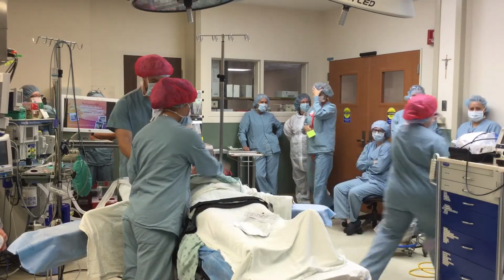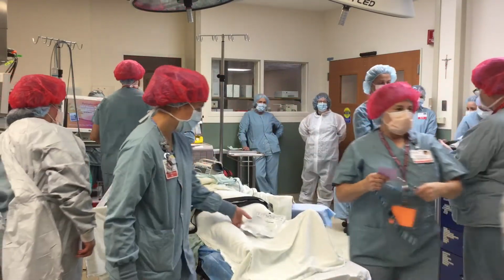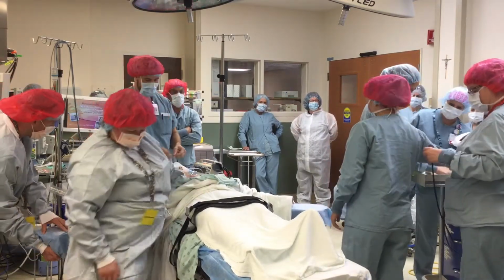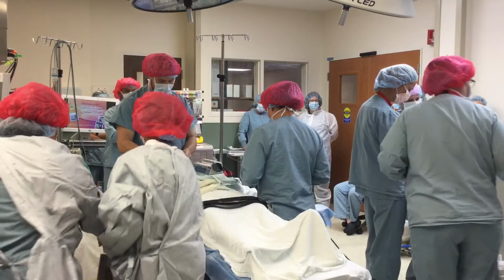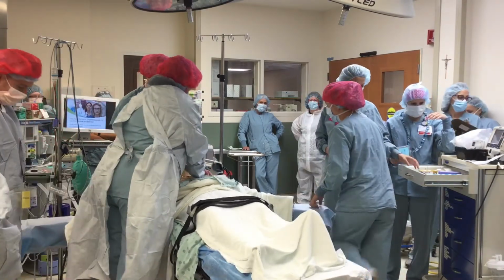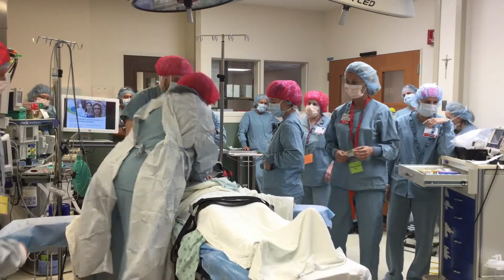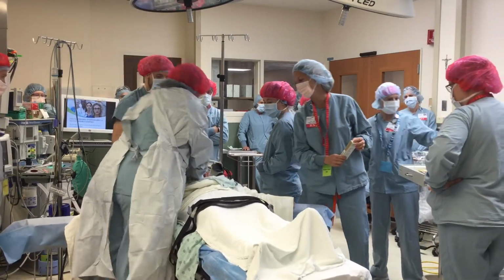Somebody needs to start CPR. We need a compressor to start CPR. I need a documenter. We have a secured airway. Okay, so I'm gonna have you document. The patient is on a ventilator. You don't need to synchronize with breathing. Ventilator is working, you can do CPR.